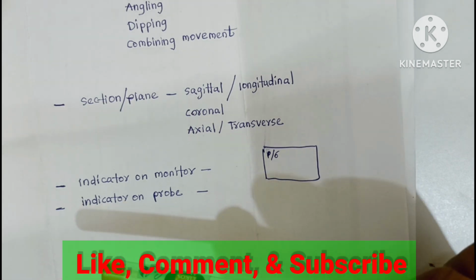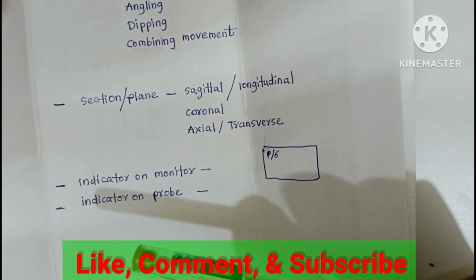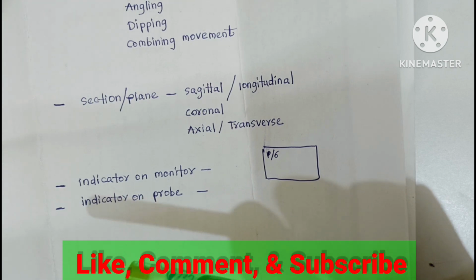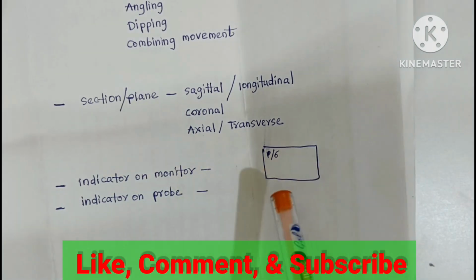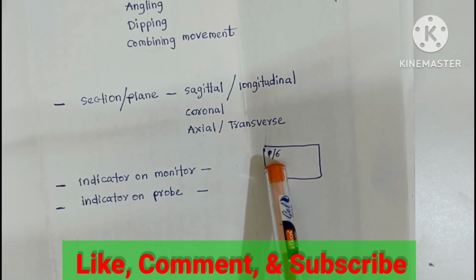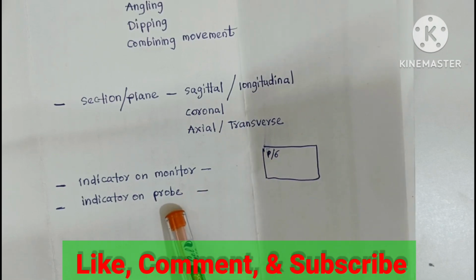Now the indicator on the monitor. In case of transverse view and longitudinal view, the indicator should be present at the left side and top of the screen. That is the indicator on the monitor, and the other is the indicator on the probe. Then we discuss different types of probe movements.